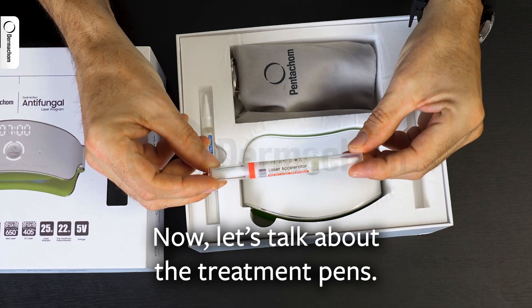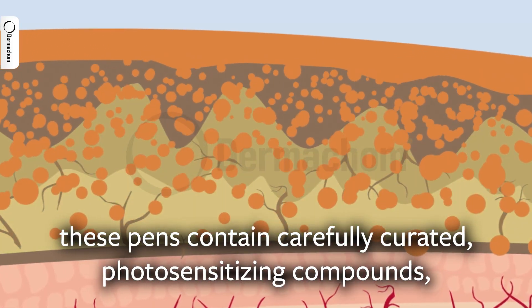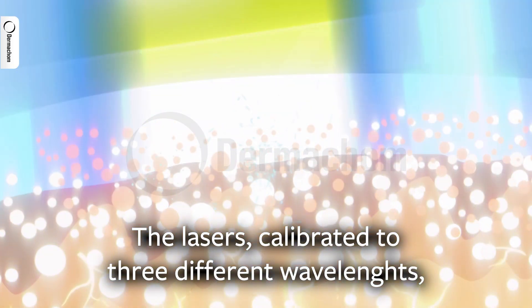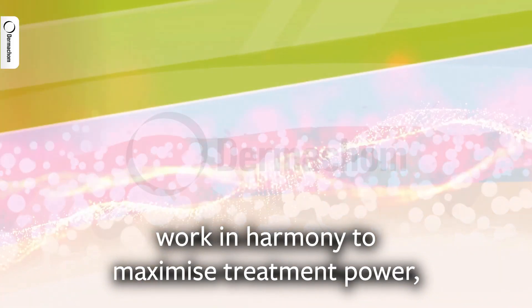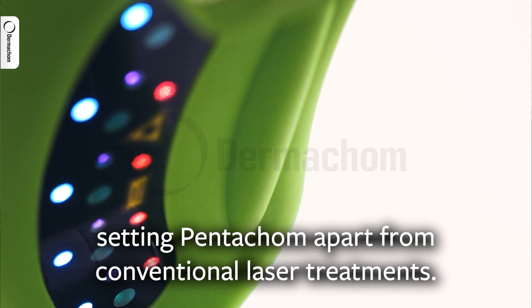Now, let's talk about the treatment pens. These pens contain carefully curated photosensitizing compounds, elevating the power of the laser therapy. The lasers, calibrated to three different wavelengths, work in harmony to maximize treatment power, setting Pentachom apart from conventional laser treatment.